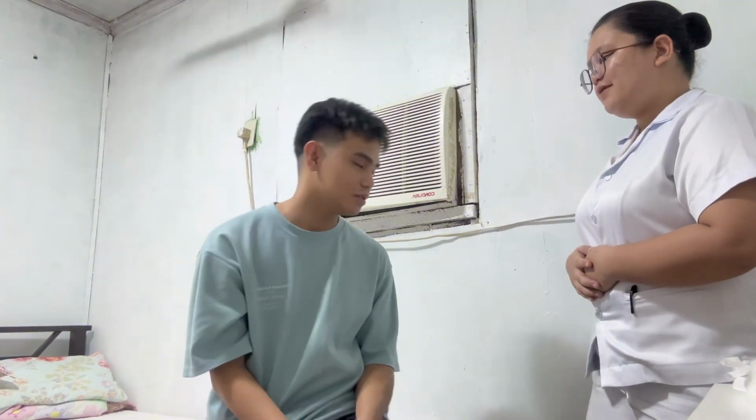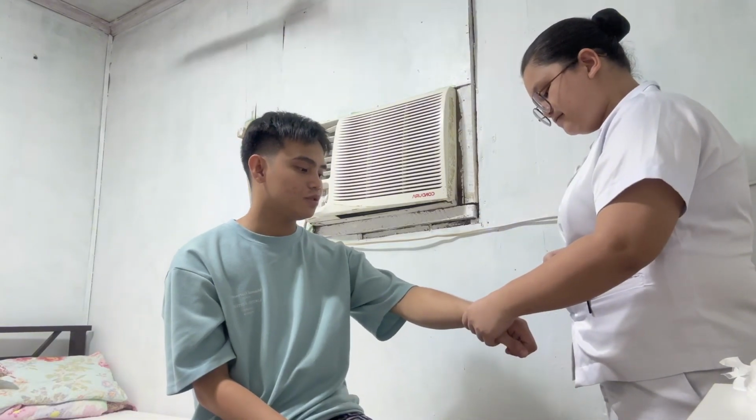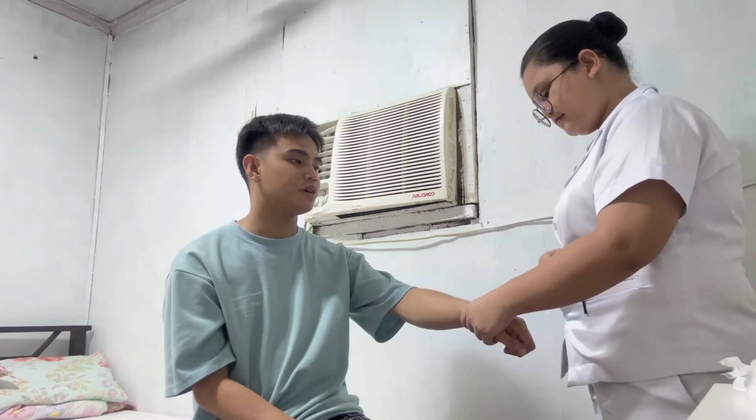Hello sir, I am Dorabel Kelapinik from Novo Doctors College, and I will be your student nurse for today. May I please see your wristband, sir, and kindly state your name and your birthday? Joshua Alexis Sumugod, September 5, 2004. Alright, so Sir Josh, today I will be assisting you in injecting the insulin shot.